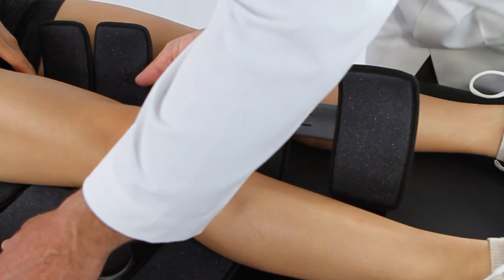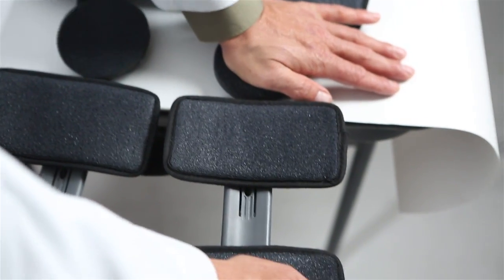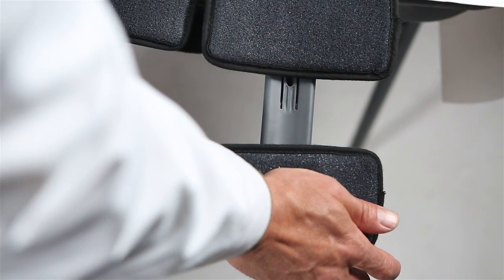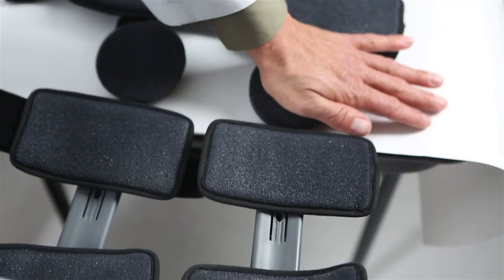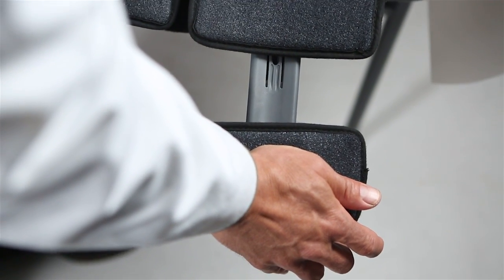If the hinges don't reach the knee, you'll need to remove the brace from the patient's leg. Bend each bar by holding the thigh-calf bar against a solid surface. Apply gentle and constant pressure to the hinge in the desired direction. Bend each sidebar an equal amount above and below the hinge.